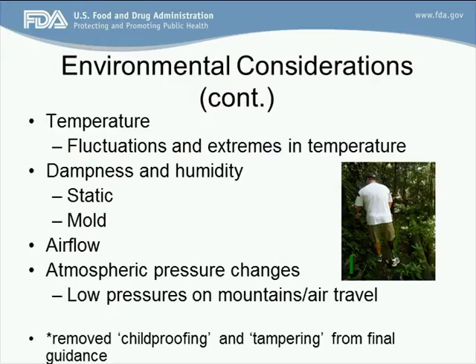You're going to look at dampness and humidity. If it's too dry, are you going to have problems with static? Can you get sparking? Can that affect how your device is functioning if you have too much static with your device? Or is there a propensity for it to grow mold? And that has happened as well in too humid of an environment.